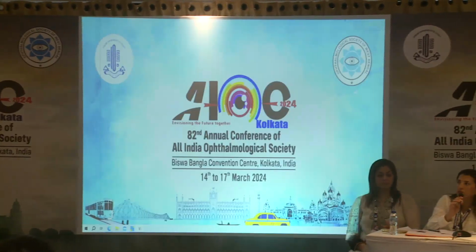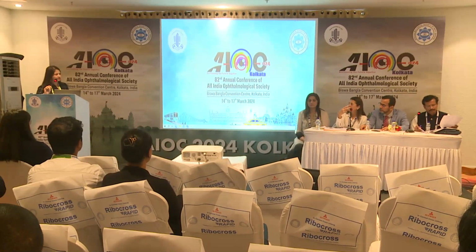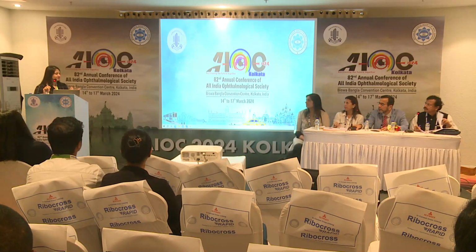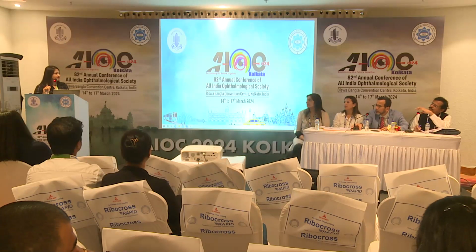So you have not mentioned which OVD you used. Yeah, we have used HPMC 2%, hydroxypropyl methyl cellulose 2%. But using hyaluronate helps to take out the OVD faster. Faster, yes. Any reason why you chose that? It is the one which we use regularly, and it is also a little cost effective. But in ICL surgery, the cost is anyway higher. But that is what we use in routine practice, HPMC 2%.